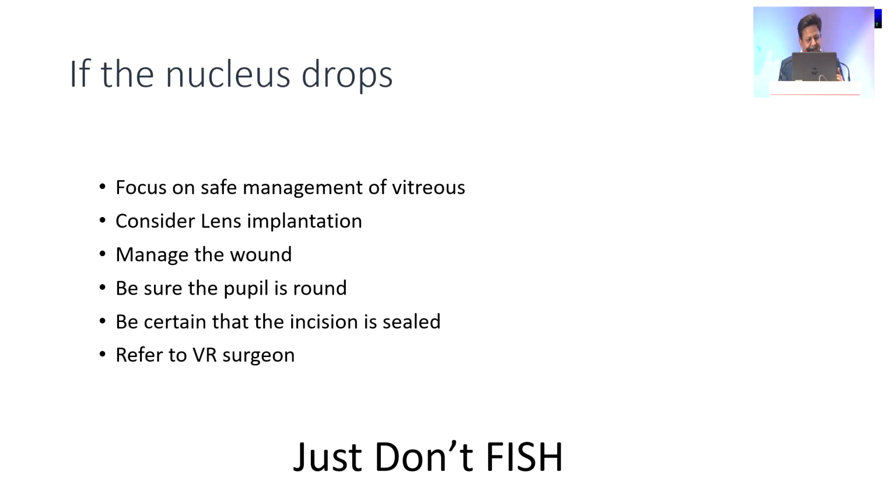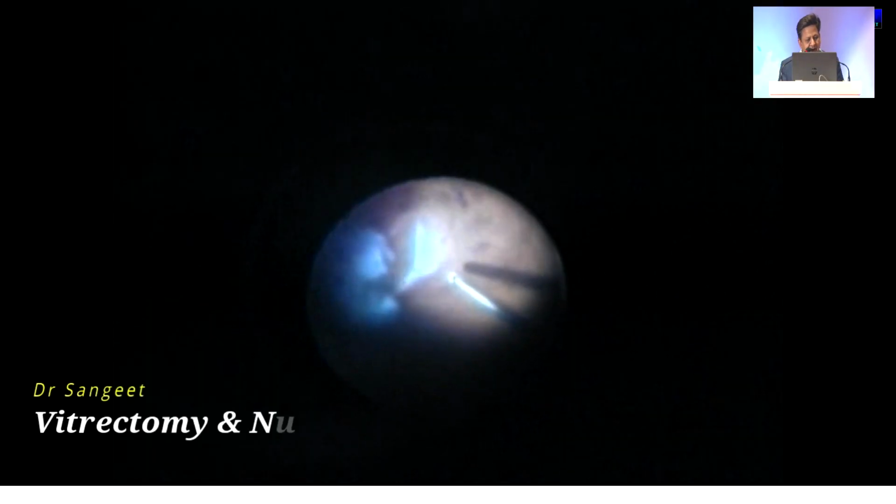And the one message that I would like to give is, just don't fish. Just focus on safe management of the anterior vitreous. Consider lens implantation if you could. Manage the wound and don't fish. And you see what happens if you fish.